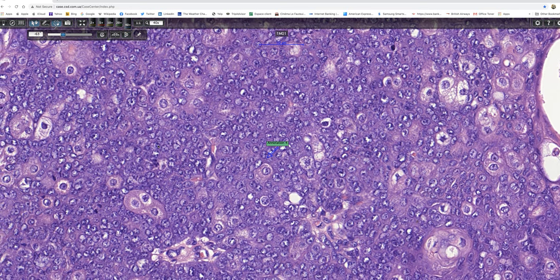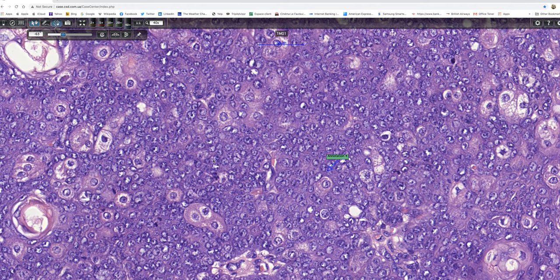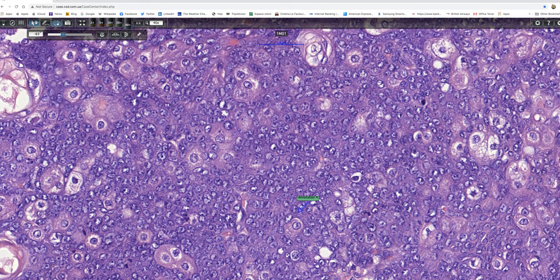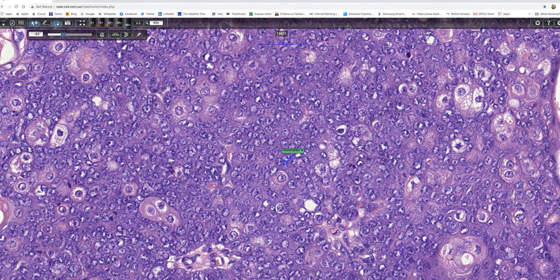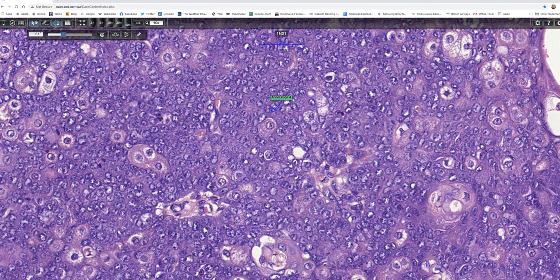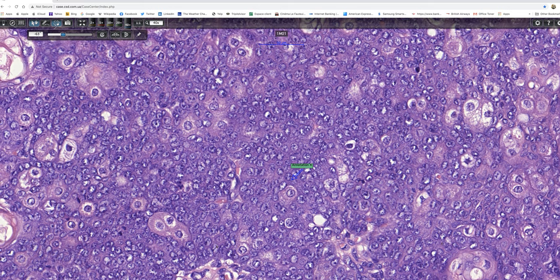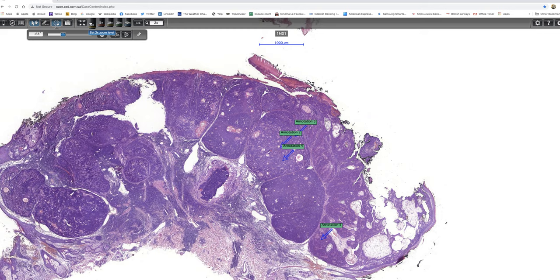This field was just to show some nuclear pleomorphism and conspicuous nucleoli, and there's another mitosis there. As I've said, in the overall scheme of things, mitotic activity doesn't separate sebaceoma from sebaceous carcinoma very easily. But I think this is a fascinating tumour.